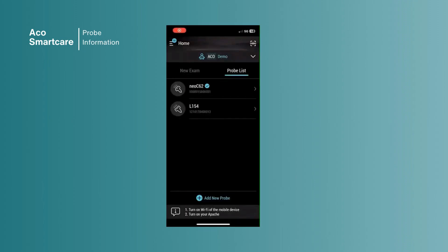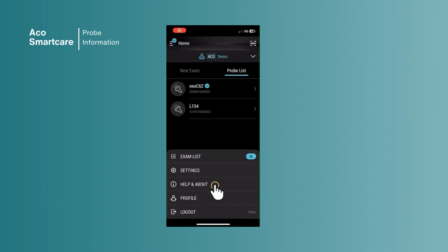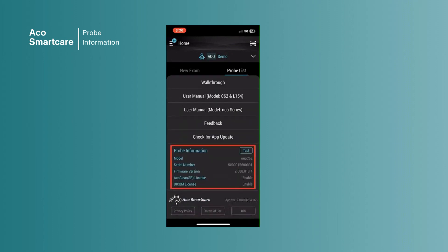To see the probe information, make sure the probe is turned on and connected. This section shows the model name, serial number, firmware version, statuses for Echo, Clear, and DICOM, and a test button to report any issues.